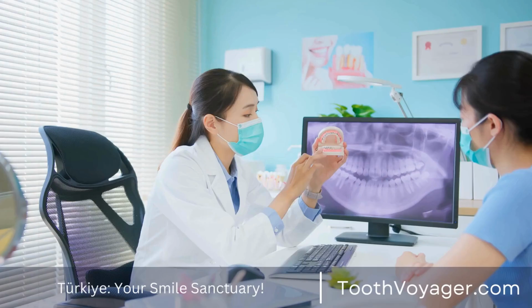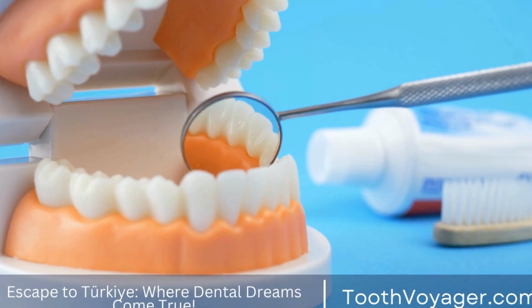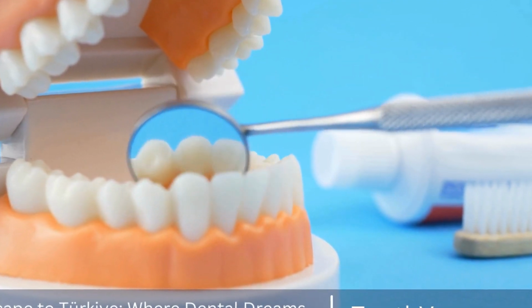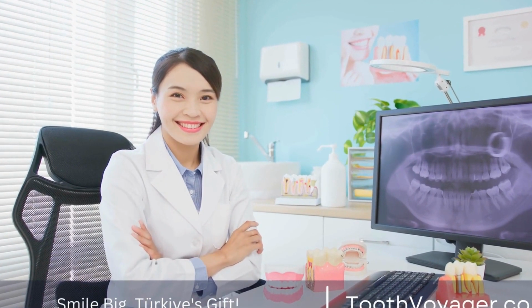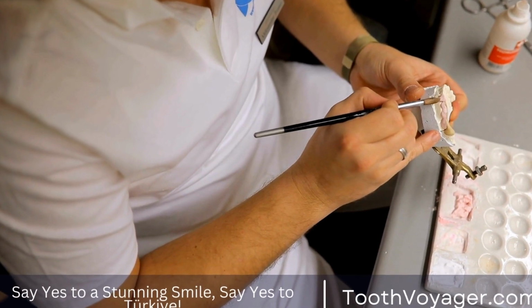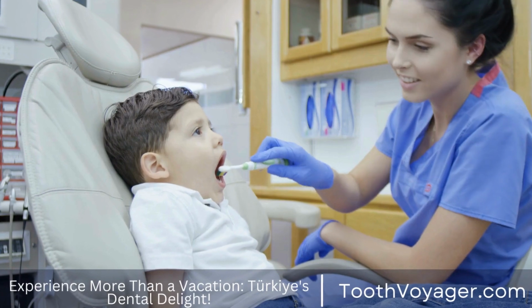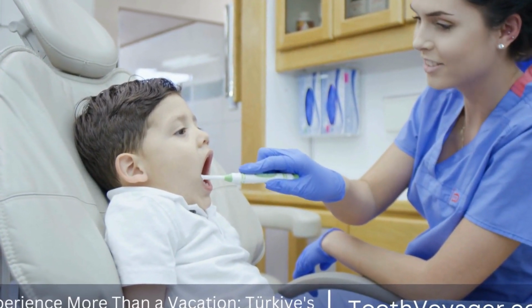2. Mini implants. Mini implants are the smallest version of the traditional implant, with a diameter smaller than 3 millimeters. These implants are commonly utilized in instances in which there's insufficient bone mass to hold a traditional implant, or when the patient doesn't want to undergo invasive surgery. Mini implants are easy to put in and need shorter healing times than conventional implants. They're a great choice for those who need minimal tooth replacement or for stabilization of dentures.